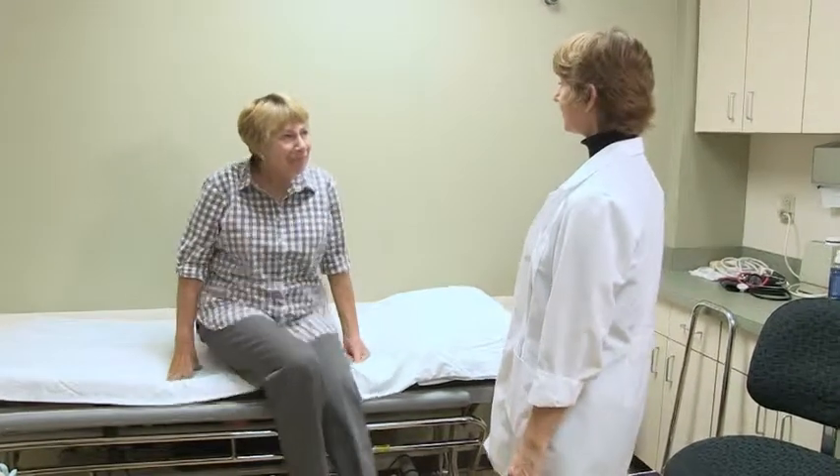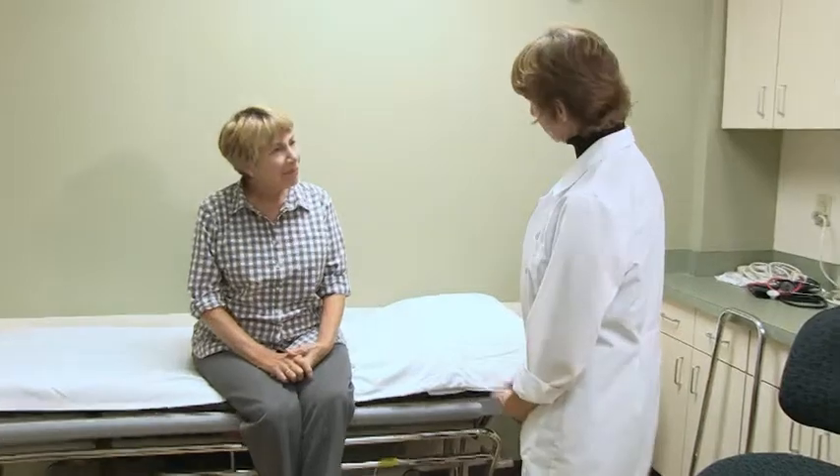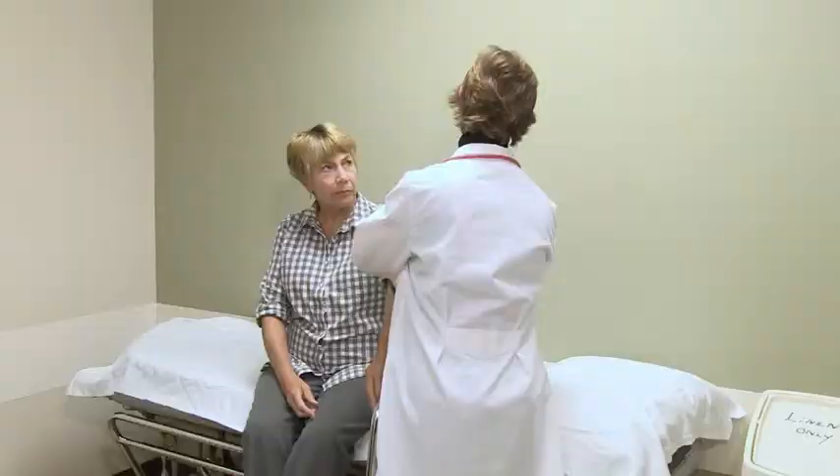The technologist will begin by explaining the exam to you. They will then take a brief medical history. Your blood pressure will also be taken.